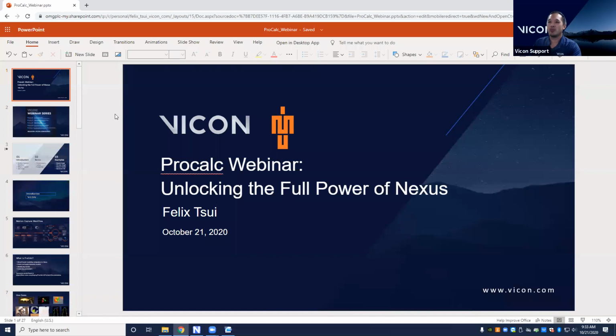Hey guys, welcome to the ProCalc webinar, Unlocking the Full Power of Nexus. I want to thank you guys obviously for the opportunity to speak to you. I've been with Vicon for 8 years now, and I think this is my first webinar, so go easy on me. As Alicia said, we will be doing Q&A at the end. I'd hoped to do it during so that people could ask questions as we go, but I don't think I can actually monitor the questions at the same time as sharing my screen, unfortunately.